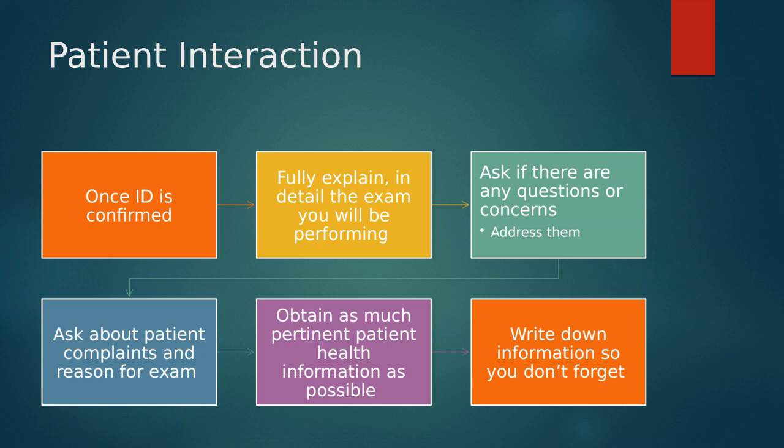So make sure you have that upfront initial communication. Ask the patient about their complaints and the reason for the exam. Make sure they understand why they're there, why their doctor ordered this. Get as much information from that health history as possible, but make sure that it's pertinent.